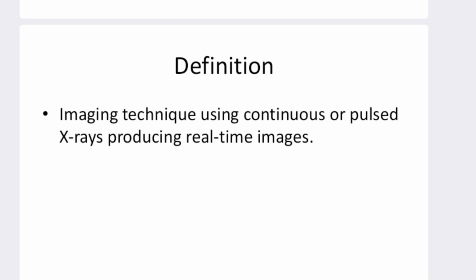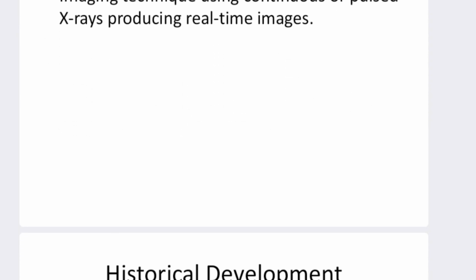This real-time imaging requires 30 frames per second, similar to television technology. This facilitates viewing the movement of the organ over a period of time, so fluoroscopy imaging possesses high temporal resolution. Since fluoroscopy is a dynamic process, the radiologist must adapt to the moving images even though the images are dull, and this requires knowledge of image illumination and also visual physiology.